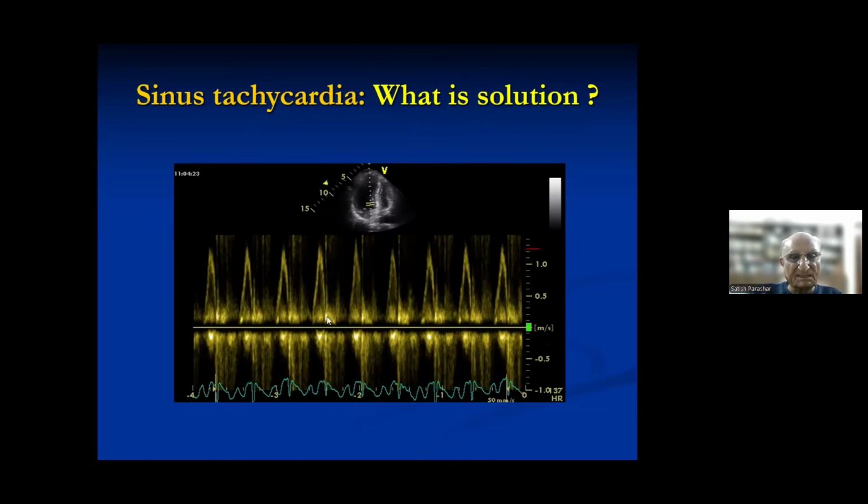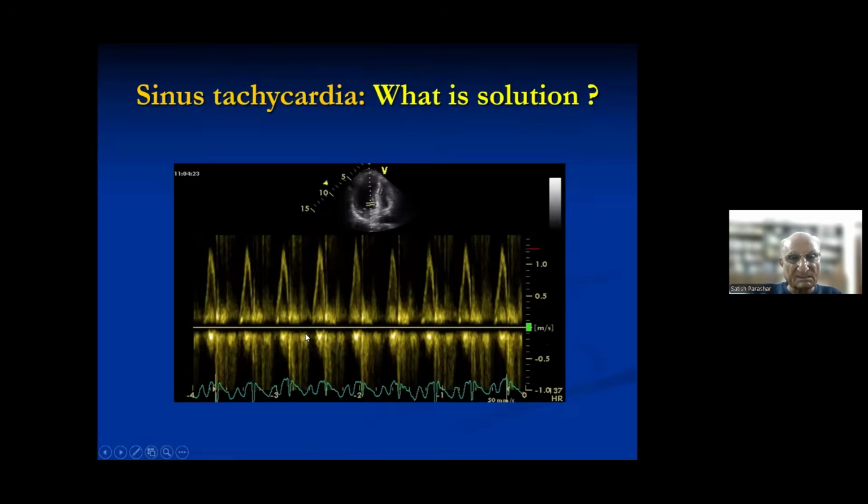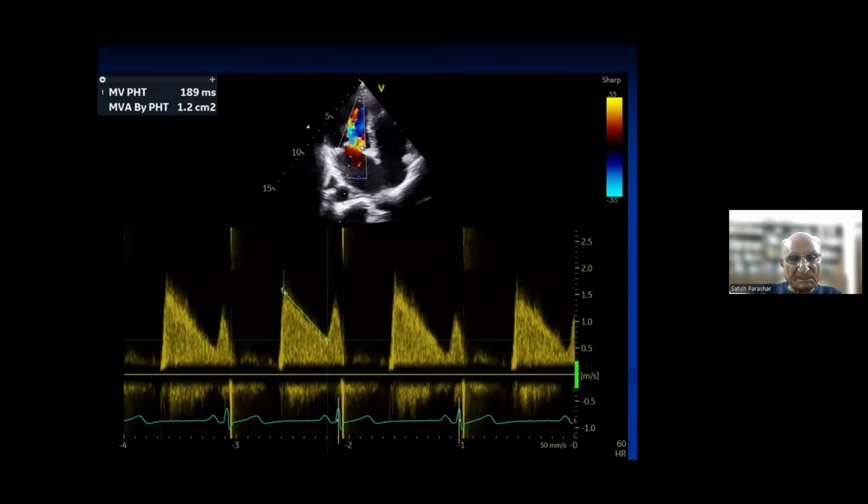We want it like this again. Now this is just to show you that when your heart rate becomes less, you get this as compared to the earlier one. So this is our aim. Here you see the heart rate came to 60, but every time it may not be there. The main idea is that there you cannot see anything, but here you can see the whole slope, and you can plainly trace it to get a peak and the mean gradient. As I told you, whenever you trace an envelope, you get a peak and the mean gradient. So this is what we do.